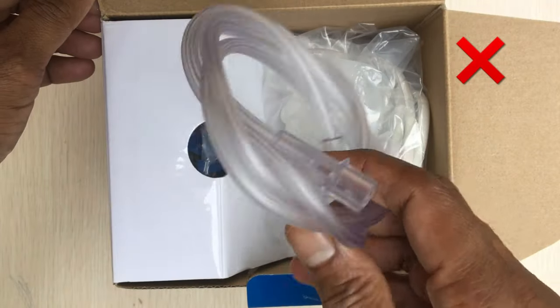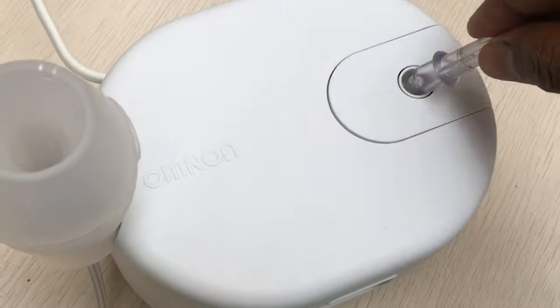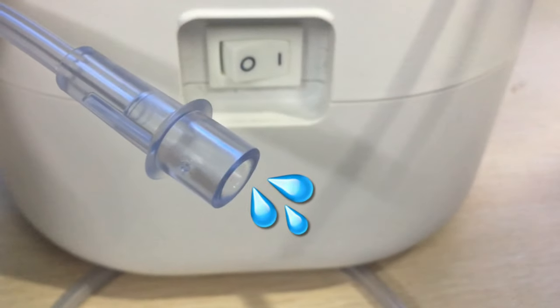Never use these cleaning methods to clean the air tube. If you find moisture inside the tube, then connect it to the compressor and switch on, so the device pumps air to expel moisture.